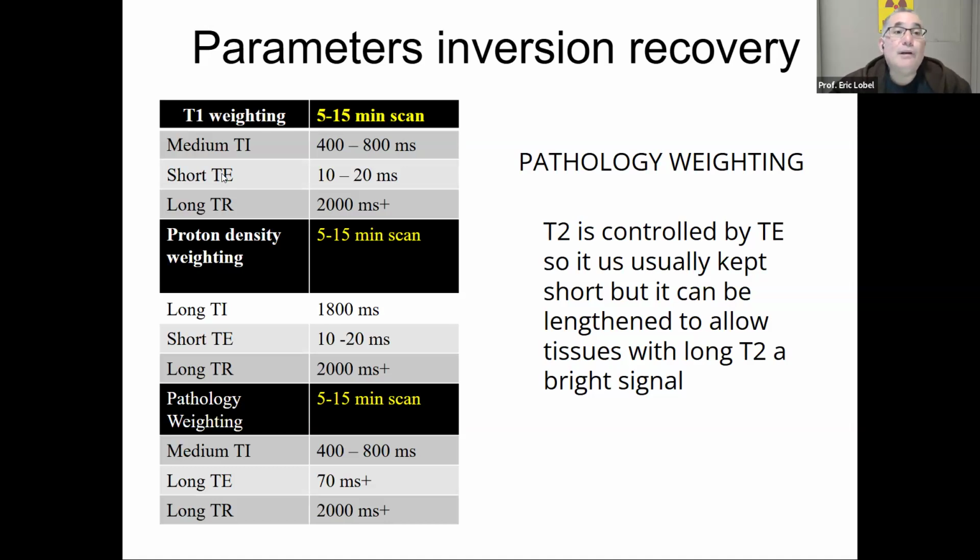But it's this part: short TE, this is not a typo. This normally would be short TR, that's what you want for T1 weighting. But I'm pointing it out here that it's long TR. But everything else is okay, right?